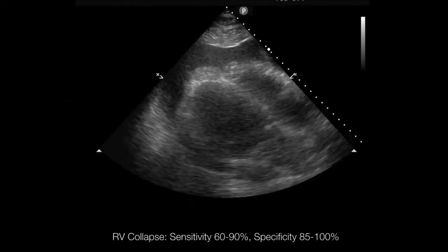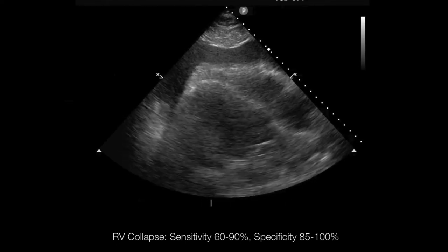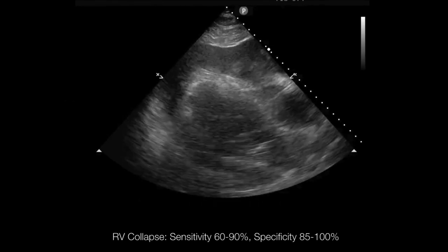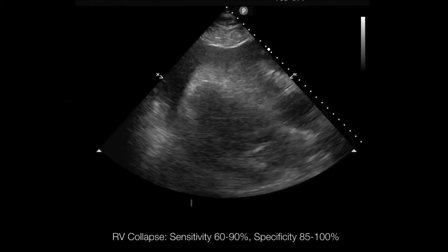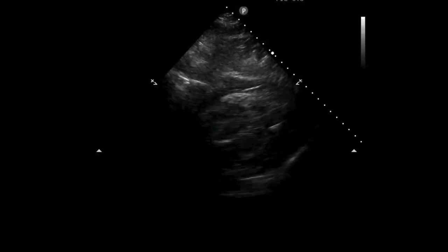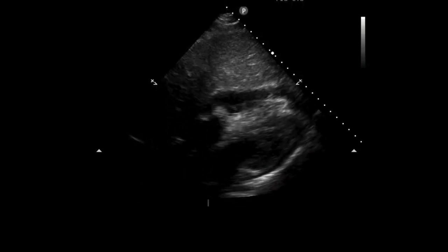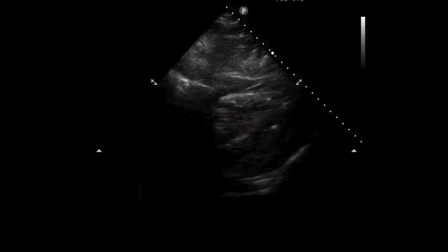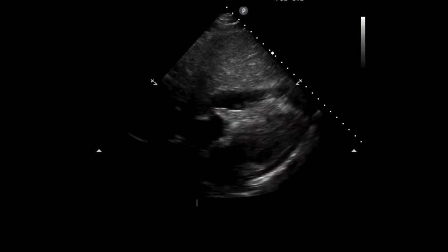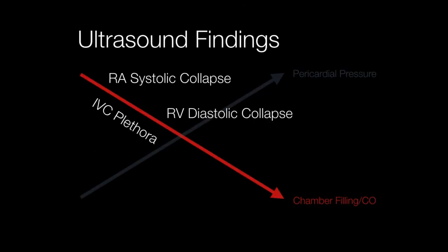You can see here — there's a large effusion, and the right ventricle is the superficial ventricle in the subcostal window. You can see a collapse of that right ventricular wall throughout the cardiac cycle. This has modest predictive value: if you don't have that diastolic RV collapse, you're probably not in tamponade; if you do, there's a good chance you are. Another example shows the RV free wall springing up and down — someone described it as like someone jumping on a trampoline.